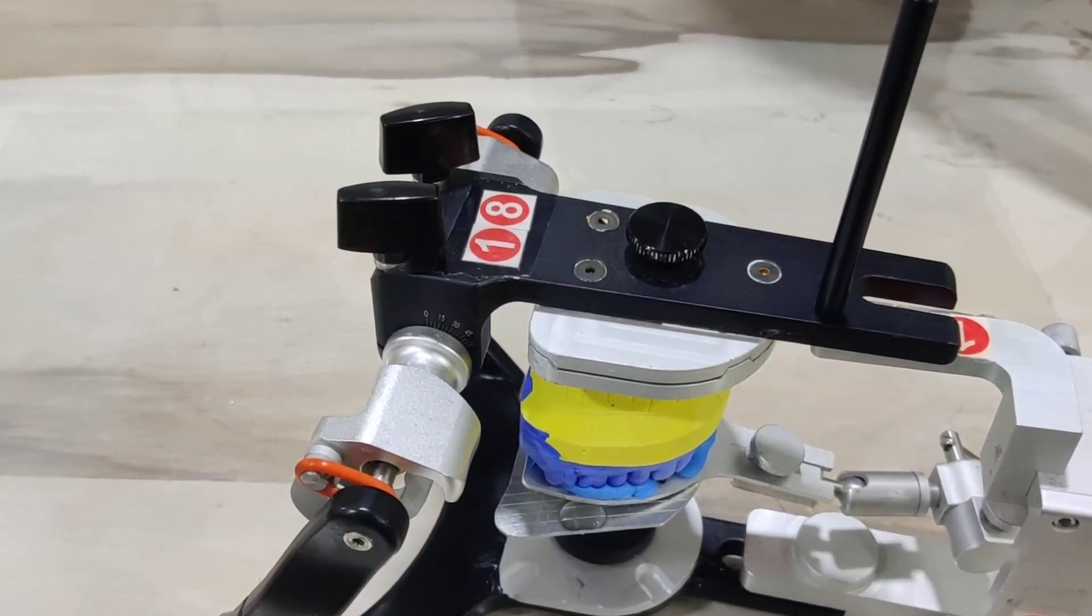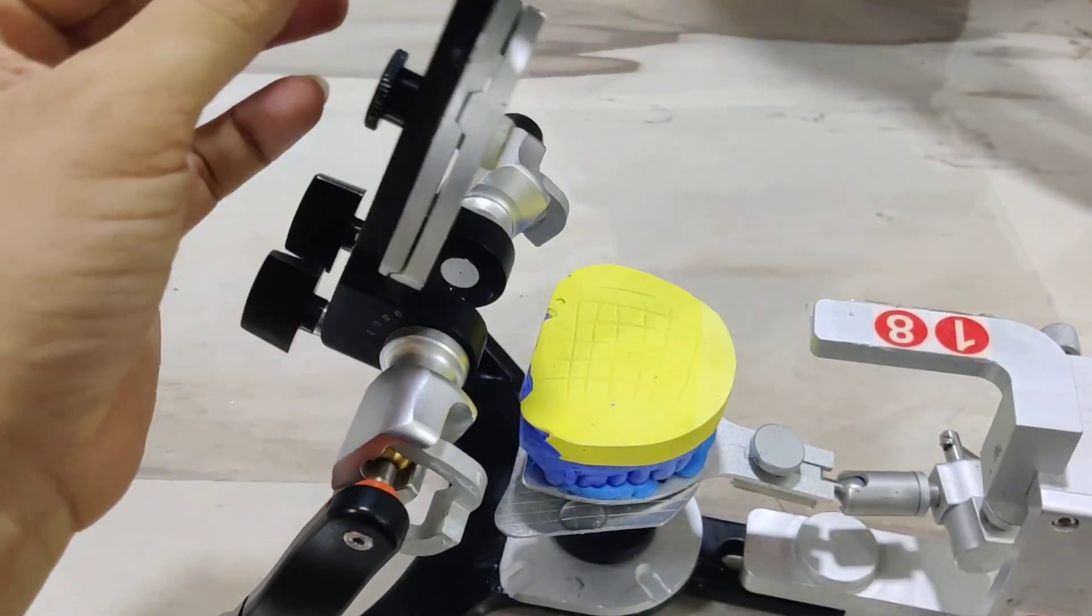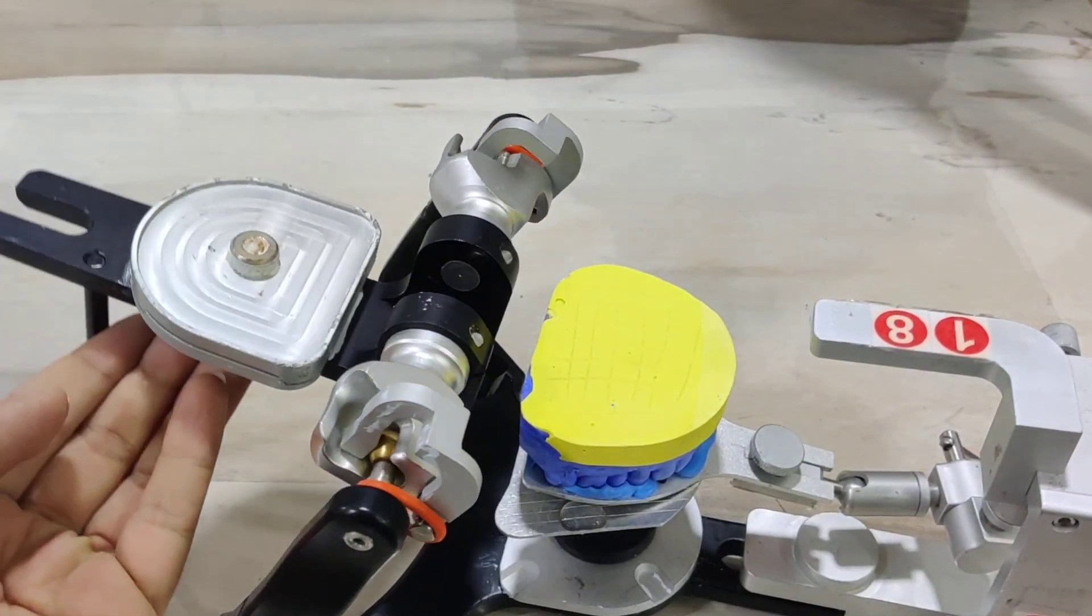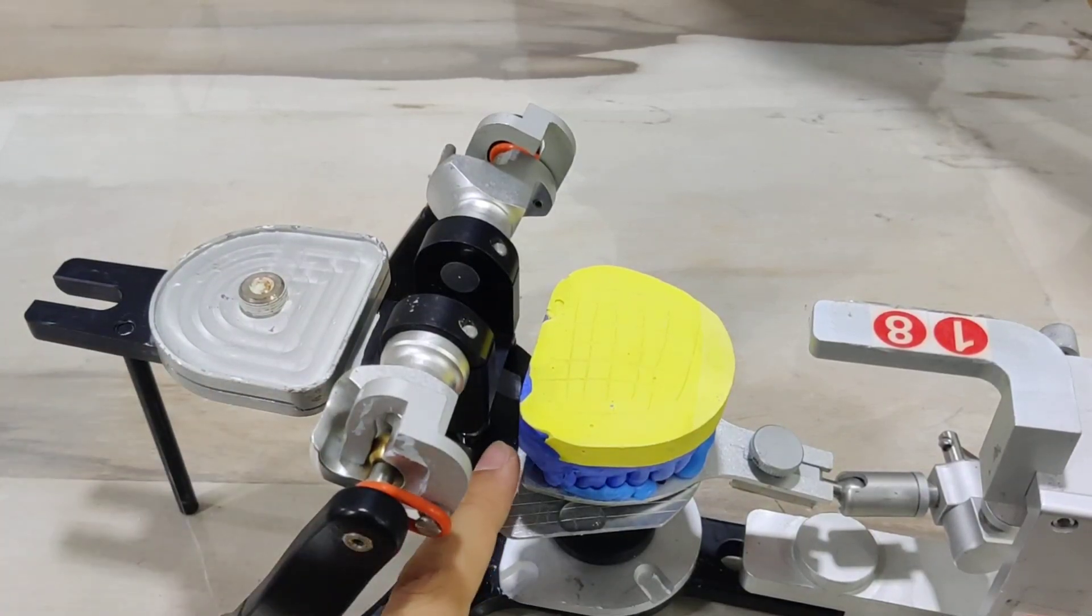When we are ready for the maxillary mounting, it helps to connect this pin here. This is available with the system and creates a static stop at the back, making sure the back end of the articulator does not disturb the maxillary cast.